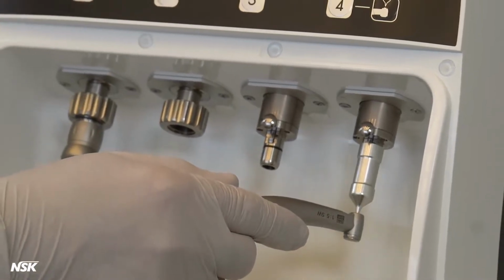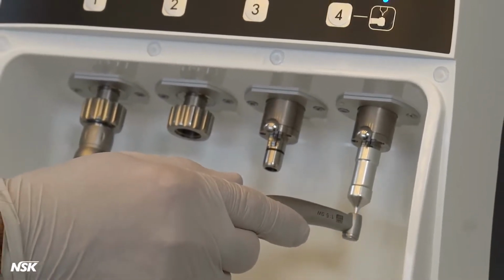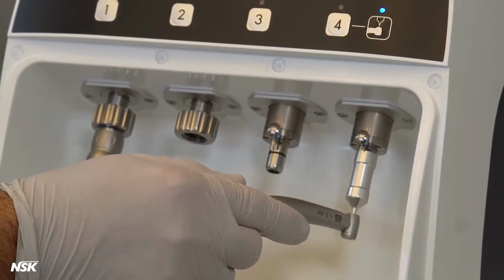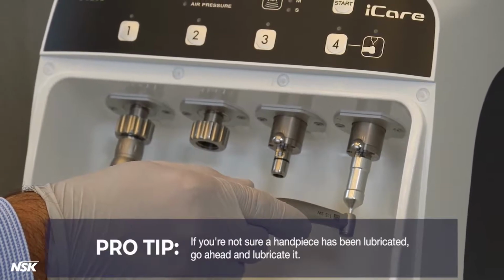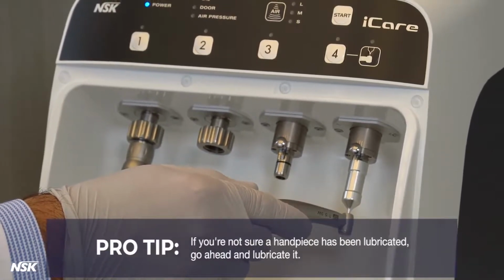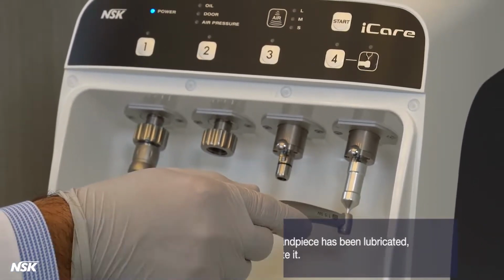However, main lubrication of the handpiece should be performed after each use and before autoclaving. Pro tip: it's not possible to over-lubricate with iCare. If you're not sure if a handpiece has been lubricated, go ahead and lubricate it.